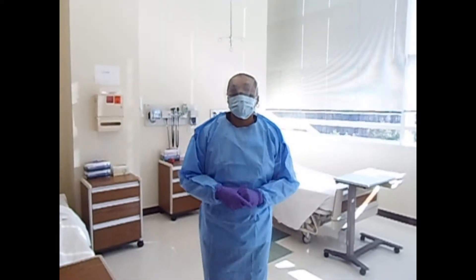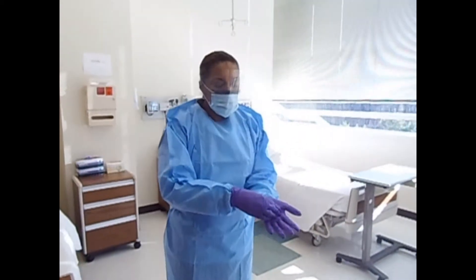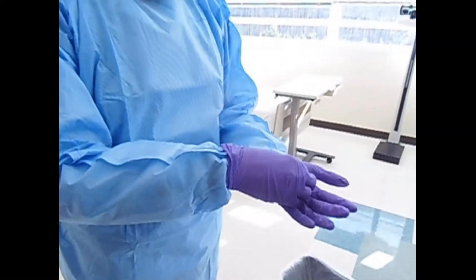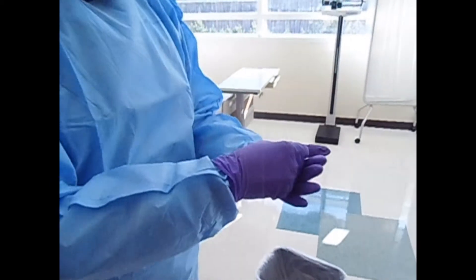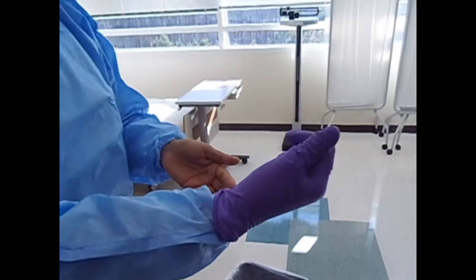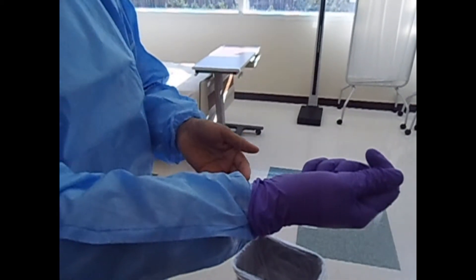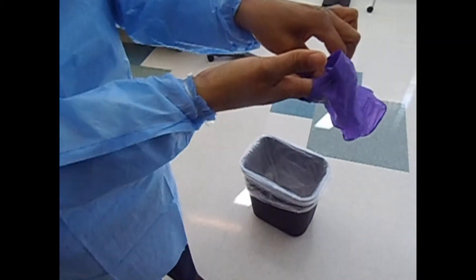The first equipment we will remove is our gloves. Take your right hand and grasp the left glove at the middle and pull. Crumble the removed glove into the other hand. Then take your index finger, go underneath the remaining glove, and bring that glove inside-out. Discard both in the garbage container.